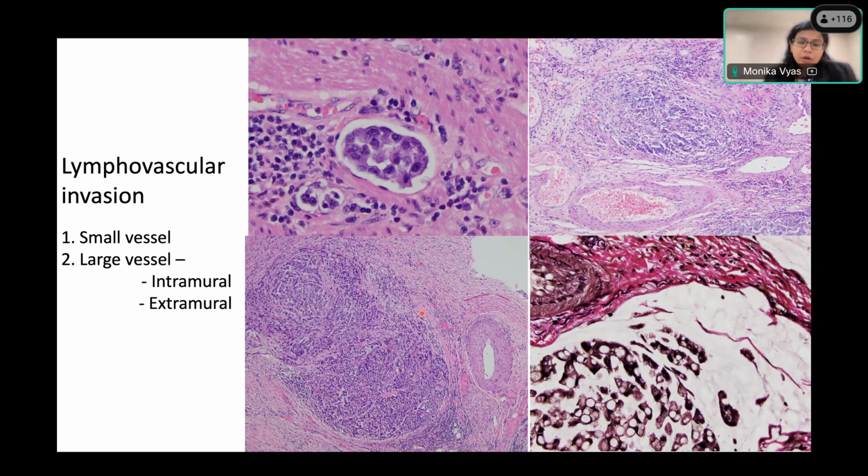But if you don't and you're not confident that this is large venous invasion, then what you can do is do an elastic stain. An elastic stain will help you demonstrate some broken elastic fibers around the tumor nodule, which will prove that this was actually a vein at some point and now has been destroyed by tumor. So large vessel invasion can be in the submucosa, muscularis propria, or beyond that, right?